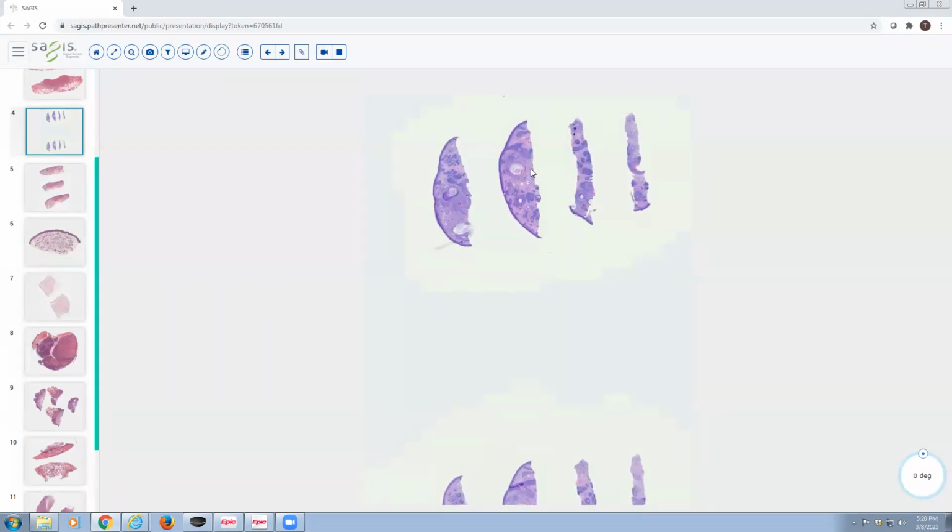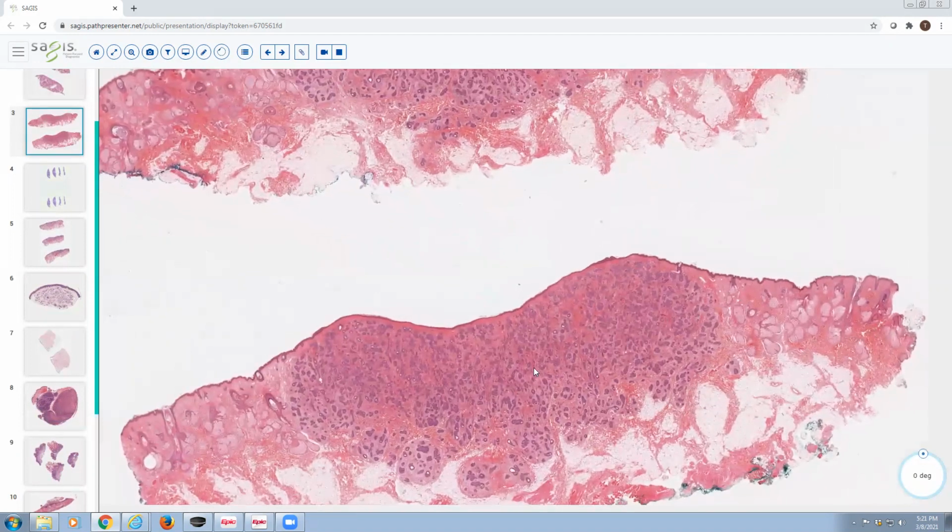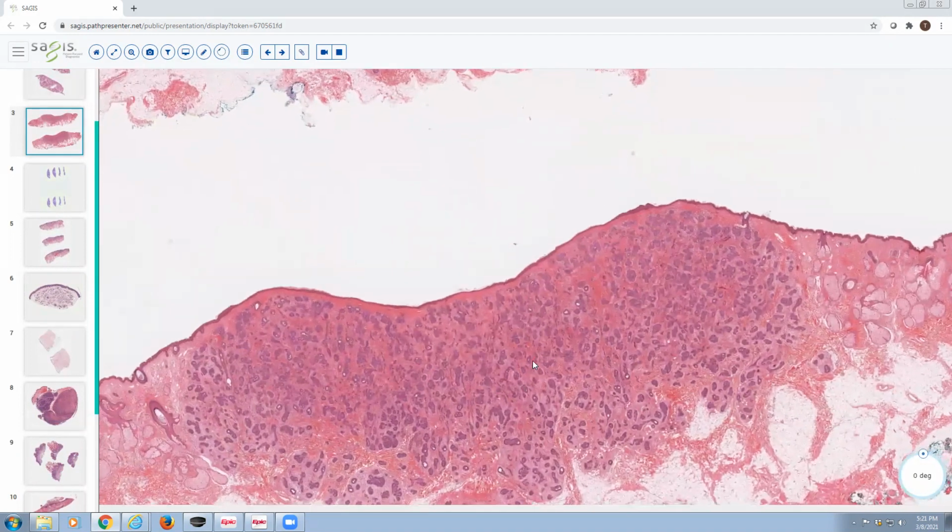Trichoepithelioma is also more differentiated towards the follicle, and you'll see infundibular structures, whereas trichoblastoma is a little bit more primitive. So blast, that suffix, implies a primitive state. And so for that reason, in a trichoblastoma, pretty much all you see are the primitive cells, the basaloid epithelial cells and the papillary mesenchymal bodies.